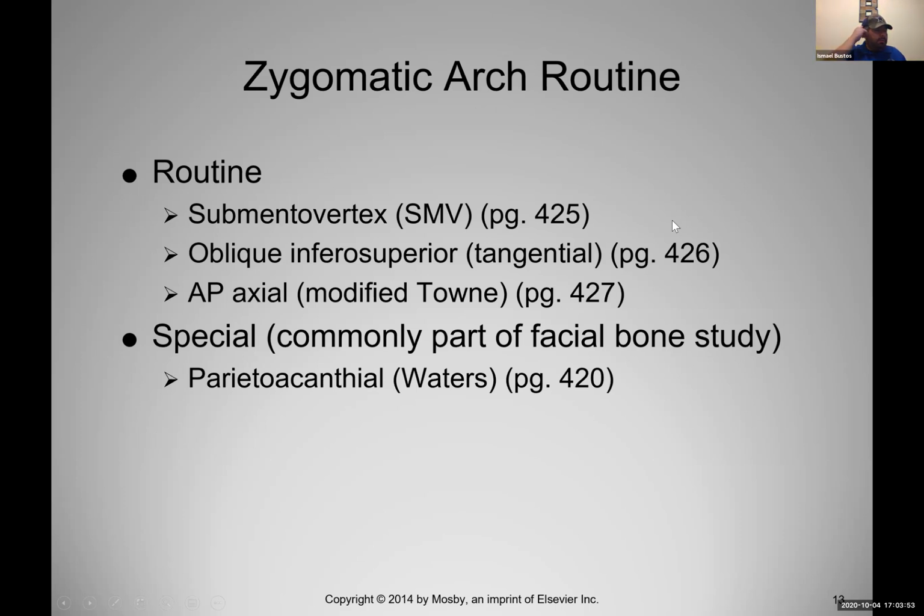All right. So that covered the nasal bone projections, only 3 of them. Now we're going to go into the zygomatic arches. A couple of these projections can be a little bit tricky, but if you look at our routine here, SMV, we talk about an SMV with the skull. So we've gone over this already.